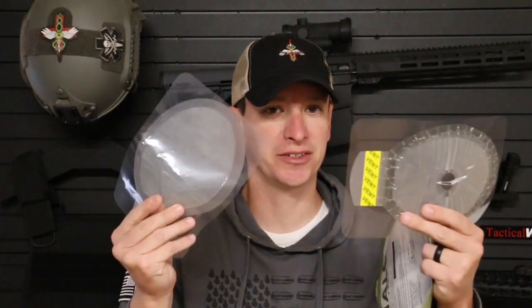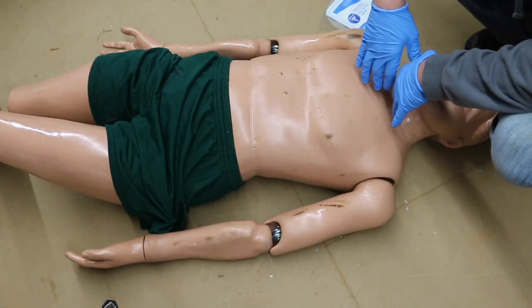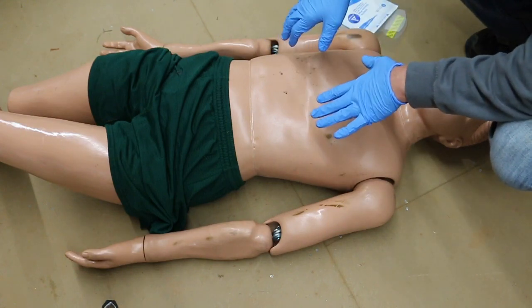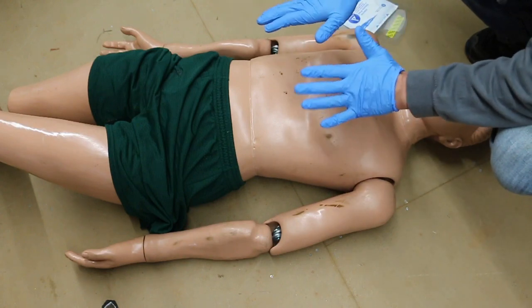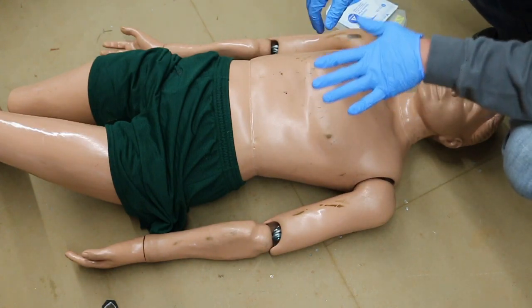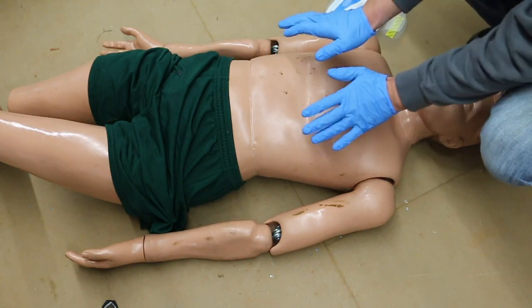So, we have a non-vented chest seal and a vented chest seal. Let's kind of talk about their theory. Alright, so we'll take a look at our patient right here. We've already taken care of any kind of massive bleeding that we need to take care of. Arms, legs, and all that's just pouring out blood, we've got taken care of. We've also taken care of any kind of airway issues that we need to take care of. Now we're on to respiratory.